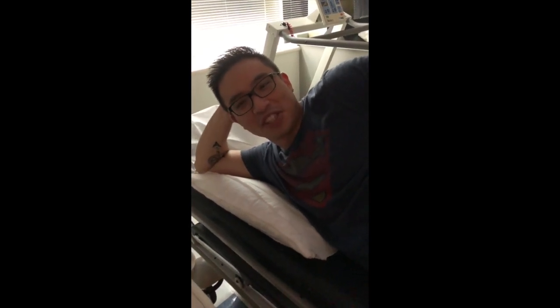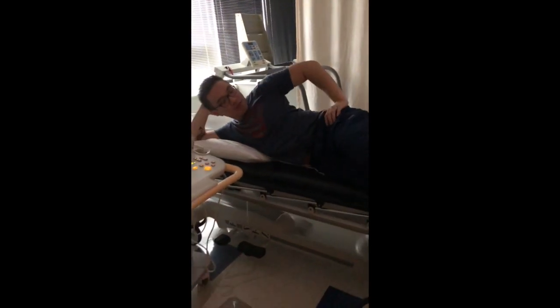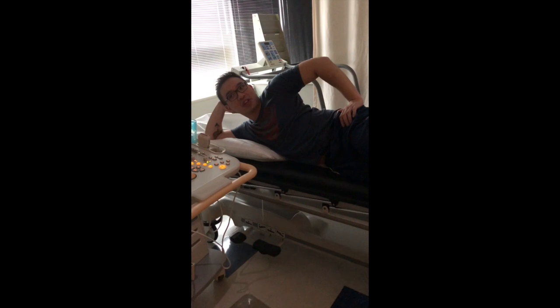Hi, it's Chris. Alright, and your date of birth? September 2nd, 1995. Alright, and the reason why you're coming in today? Having pain in my scrotal area.